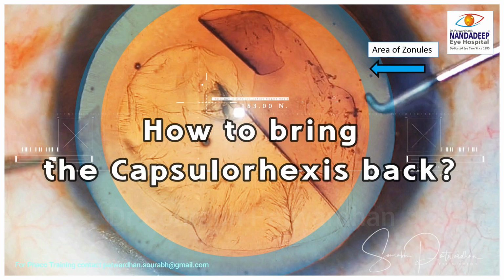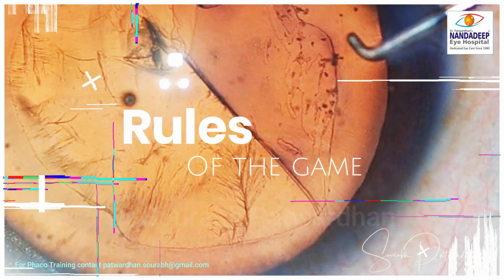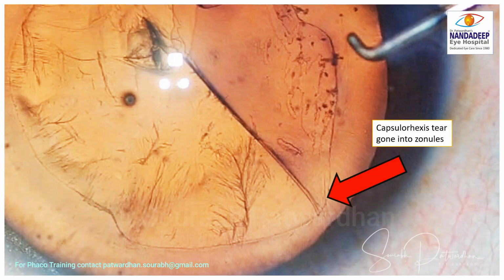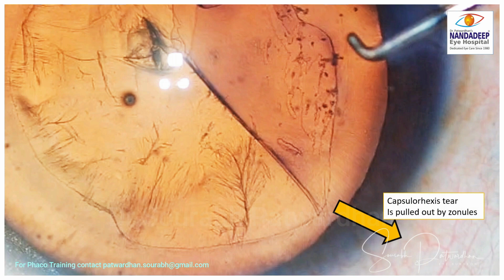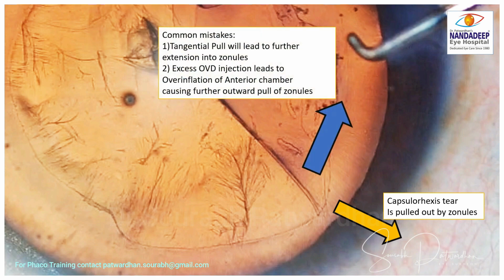So how to bring the capsulorhexis back? Let's understand rules of the game. When capsulorhexis tear has gone into zonules, it is being pulled outward by the zonules, and considering the physics involved in this situation, we have to pull the tear inside exactly opposite to the vector of the zonular traction. When you pull it exactly opposite, then only it will come inside.